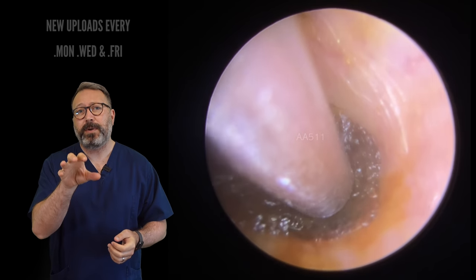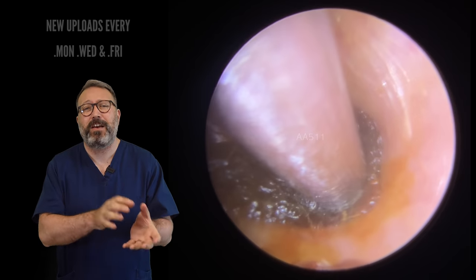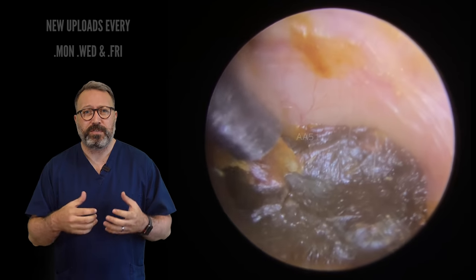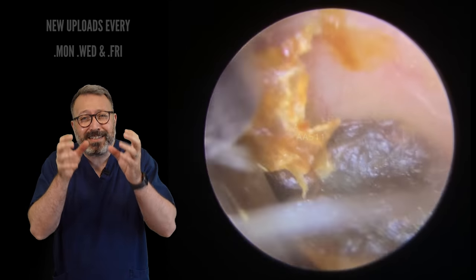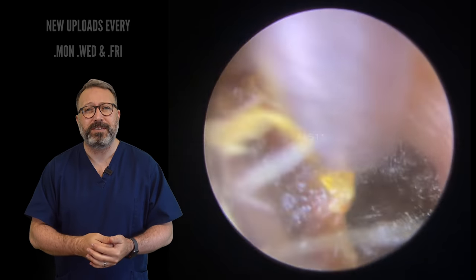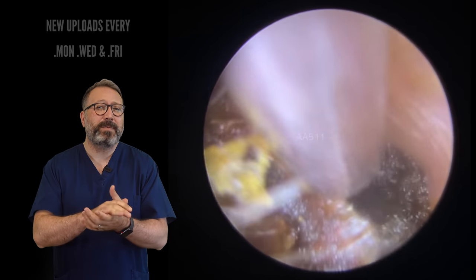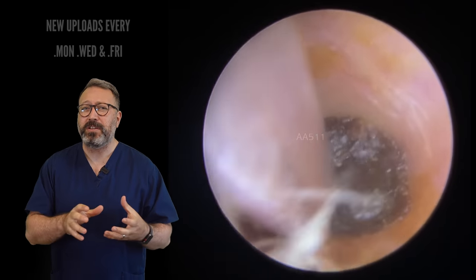With this particular patient, they've been feeling really, really blocked up for about the last nine or ten months. They've been going back and forth to their GP, who's prescribed olive oil to try and soften this wax. The difficulty, as you can see here, the wax is so deep in the ear canal, and this poor patient, just out of sheer frustration, has been trying to use cotton buds and Q-tips to clean this out. And it's just pushed this wax really deep, right up against the eardrum, and it's actually hardened into place. So a really, really tough one to do.